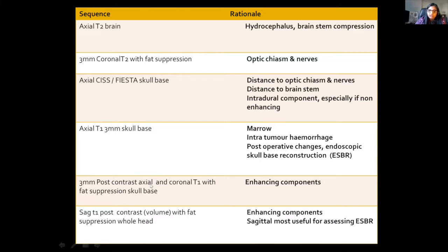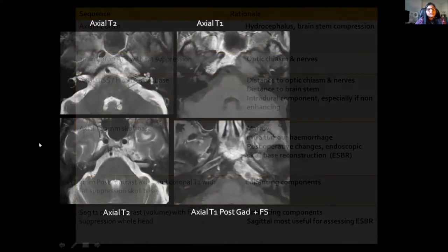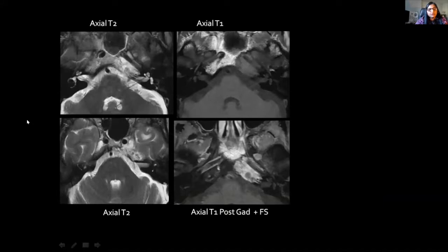On the other hand, once contrast is on board, fat becomes an enemy in the skull base, and therefore it is really important to fat suppress the post-contrast images so as to get good delineation of tumour and enhancement.